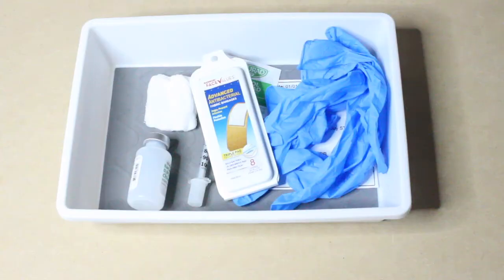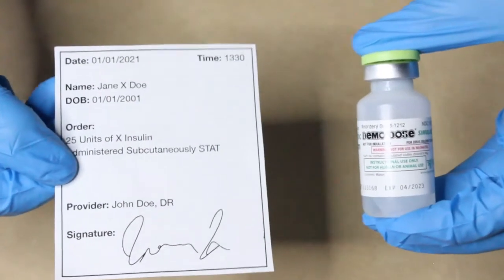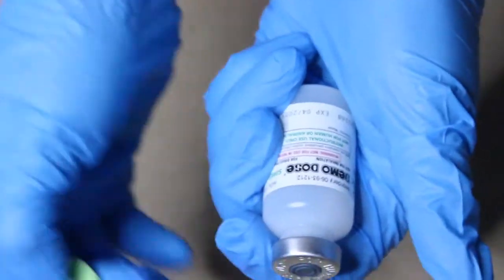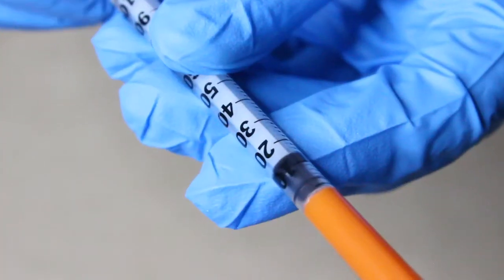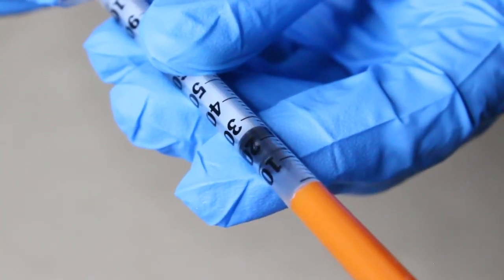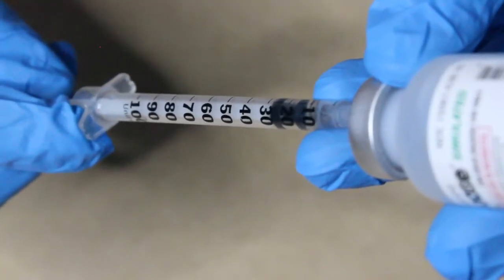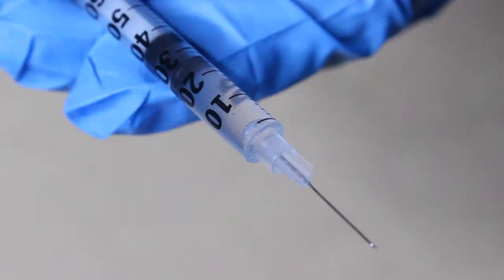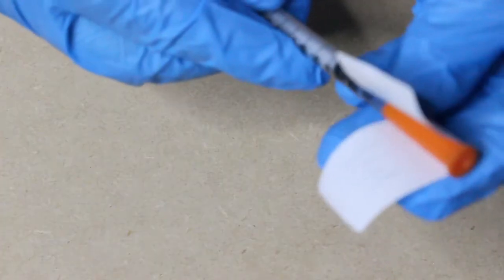Once you have all of your supplies, you can begin prepping the medication. First, locate the proper medication and remove it from where it is being stored. Pop the plastic cap off the top of the vial, then wipe the top using an alcohol swab. Next, inject air equivalent to the dosage of the medication you will be drawing up into the vial, and then flip the vial upside down and draw up the proper dosage. Once you are done drawing it up, always check to ensure there are no air bubbles by flicking the syringe with your finger.